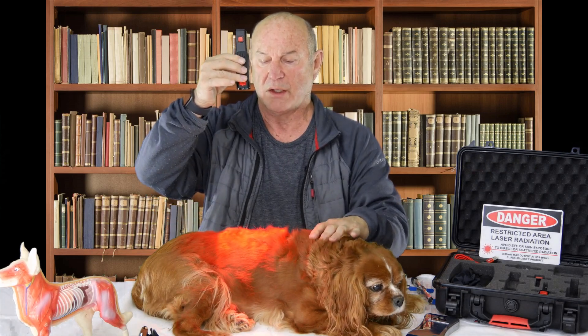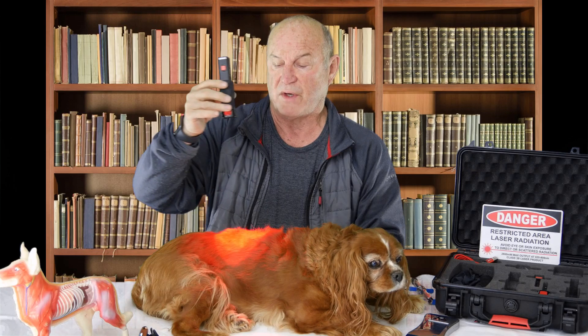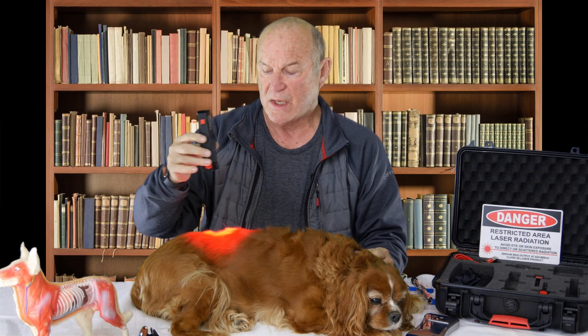We can bring it back here and laser her lower back at this particular laser level. This is the therapy. We're going to laser her for about 60 seconds; however, this device will turn itself off at 2 minutes. During that period we're lasering these frequencies: for the back, 151, 1151, 1550, 1260; for bone, 1145; 454 for cartilage; 153 for joint and joint fluid; 230 for lymphatic drainage. For pain, we're delivering 465, 25, 304; for blood supply and lymphatic drainage, 36, 42; 20.5 for connective tissue; and 111 for inflammatory pockets. That's the therapy.